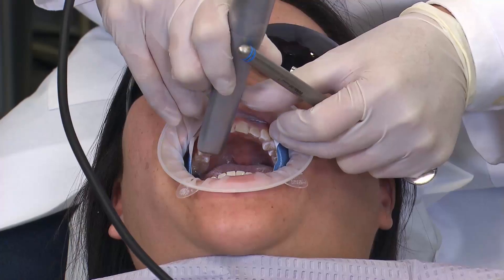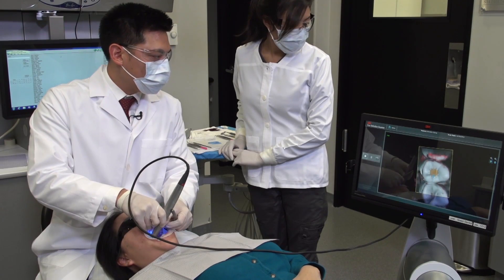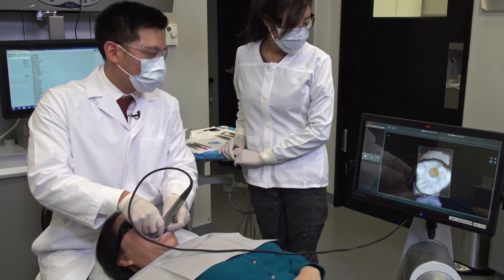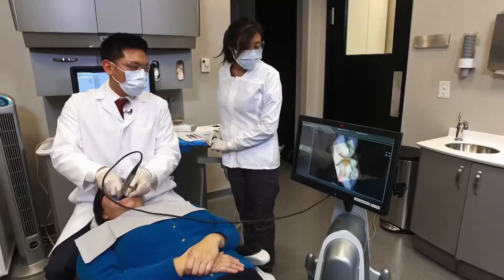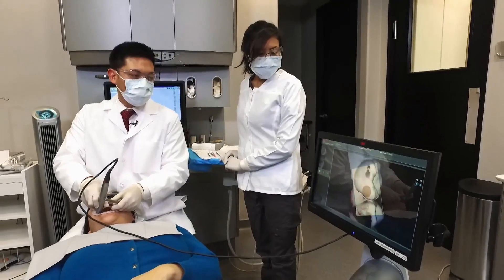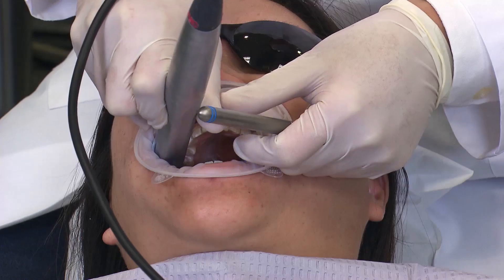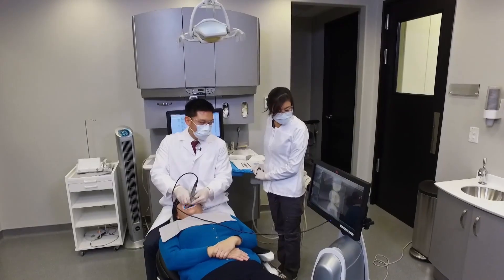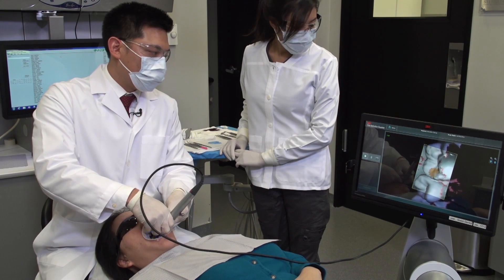I'm going to start off by capturing the upper right quadrant, getting most of the occlusal surfaces first. I work my way toward the distal and ensure I get the distal of number 2 in this case. With digital scans, you do want to ensure that you take rotations toward the buccal, as I'm doing right now, and fill in the buccal data, capturing any areas underneath the height of contour. Once I've captured the buccal, I'll rotate toward the lingual and ensure that those areas are captured as well.